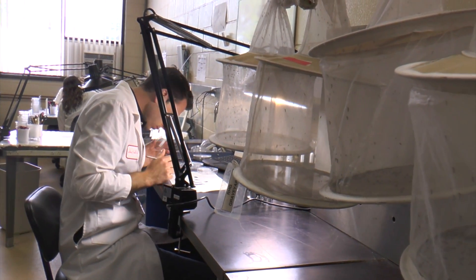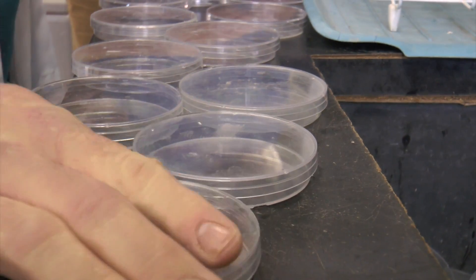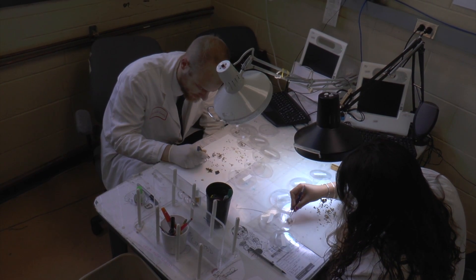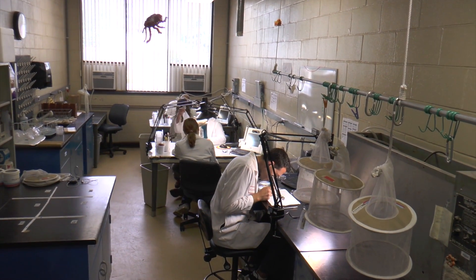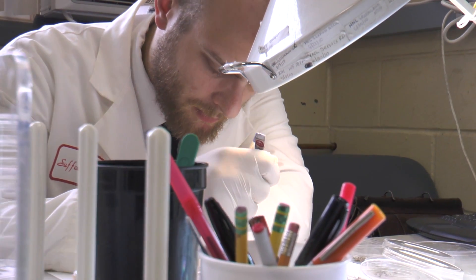These viruses are grown in culture, so it creates a laboratory hazard. You need a special level of lab to do the testing. We don't have that safety level here, so we send it up to Albany for the testing.